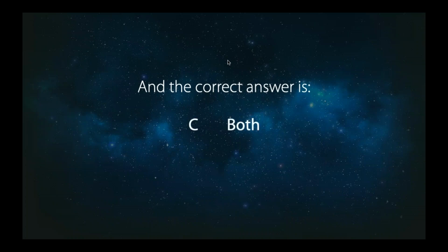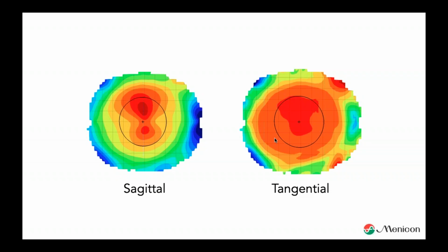You can use both. And this is a misleading question, but it is also to make you aware of the fact that we are looking at the same eye. It's exactly the same measurement. Look at this part. It's just the shape here. It is exactly the same measurement. The only thing is the map I choose: one is a sagittal map and the other one is a tangential map. So it's the same measurement, but the topographer is representing the images completely differently.